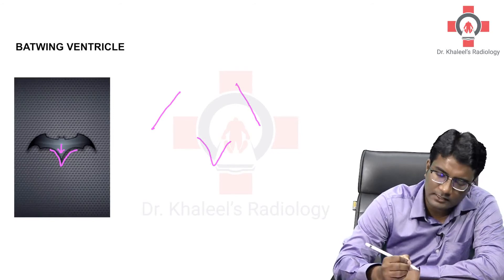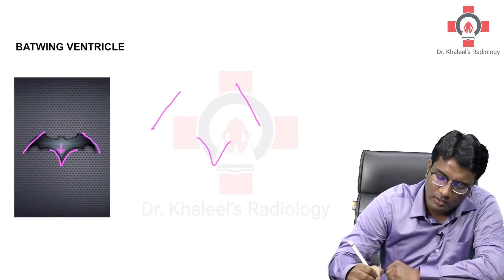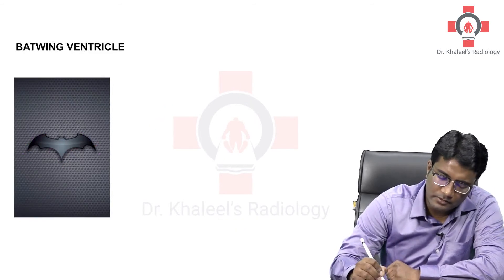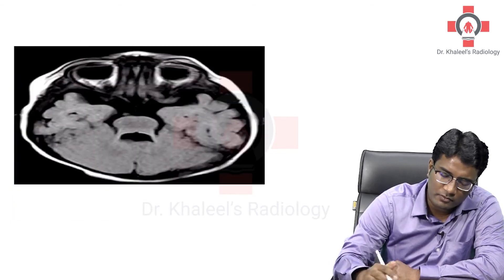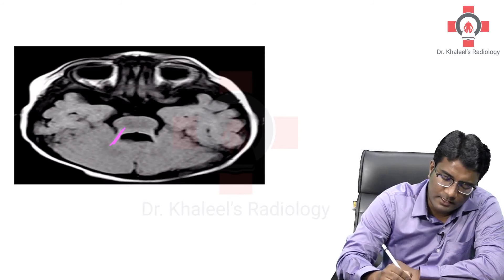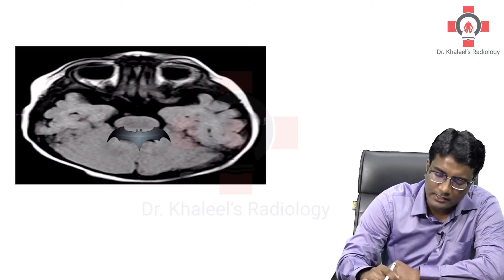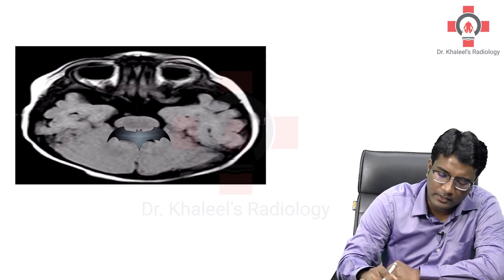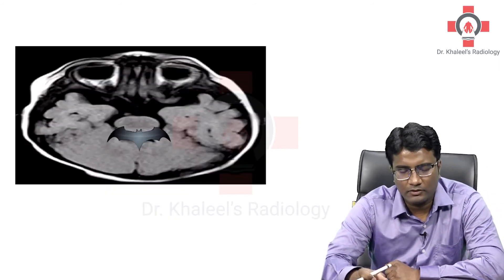So, you see the CSF signal in the fourth ventricle protruding backwards. The cerebellar peduncles are also elongated. All of this will give the appearance of a batwing. In case of Joubert syndrome, you also see the shape of the fourth ventricle. Because of the elongated cerebellar peduncles, the shape of the fourth ventricle assumes the shape of a batwing. So, batwing ventricle is also a feature of Joubert syndrome.